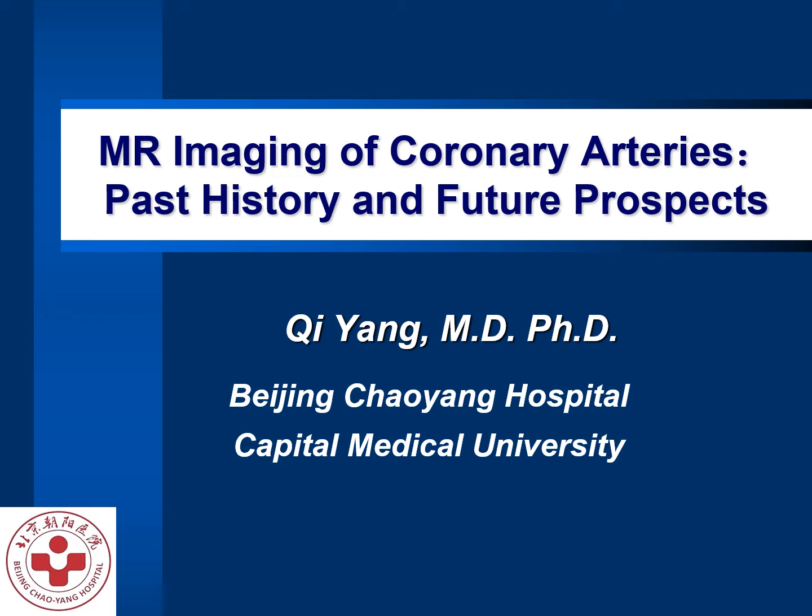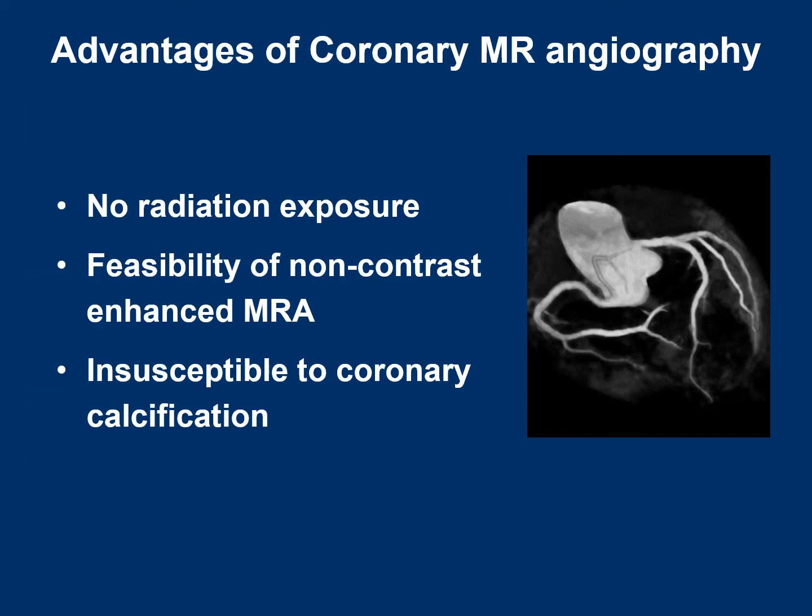I'm from Beijing, China. The topic today is MR imaging of coronary arteries, past history and future prospects. Coronary MRA has several important advantages, including no radiation, feasibility of non-contrast MRA, and also the high temporal resolution together with insusceptibility to coronary calcification.